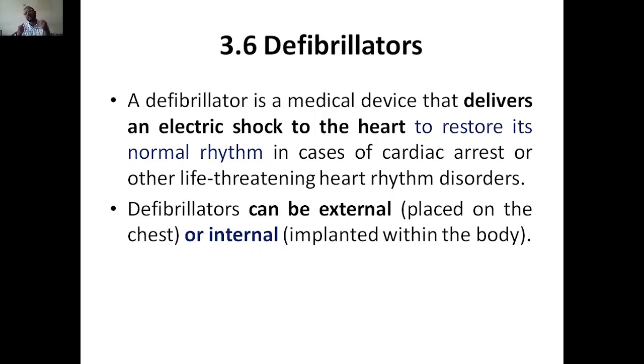We can deliver a huge amount of electric shock so that the heart restores its electrical impulse capacity, that means the normal rhythm.